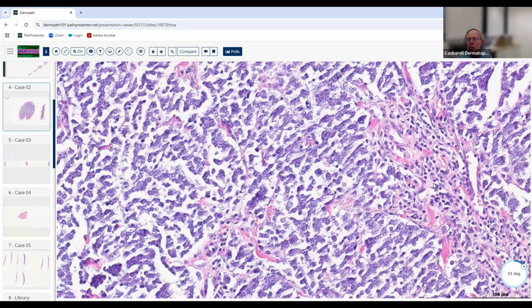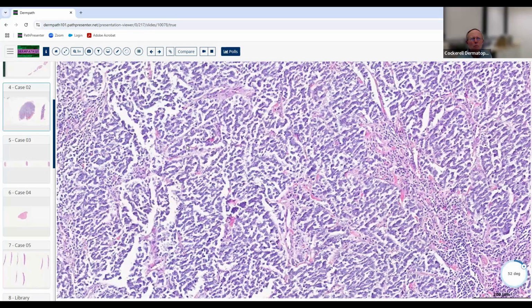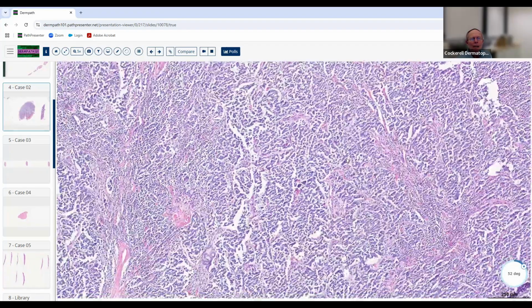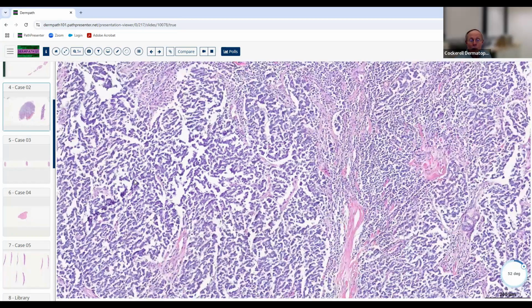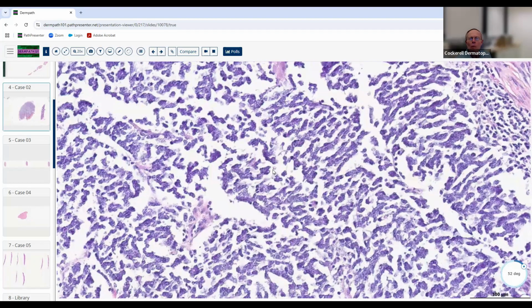These probably are lymphocytes. So if you look at the difference between the lymphocytes here and these larger cells with much more cytoplasm and this irregular chromatin pattern, you can see they look quite different. So even if this was a malignant lymphoma, the cells really look pretty different than a lymphoid cell in most of these areas. So this would be in that general category of differential diagnosis. Now, you're not going to be asked to just look at something like this and say, this is small cell carcinoma of the lung versus primary Merkel cell versus a metastatic Merkel cell, which it still could be. You might be asked to just get it into the category of neuroendocrine differentiation. And they might ask you what kind of markers you might use to work this up more thoroughly.